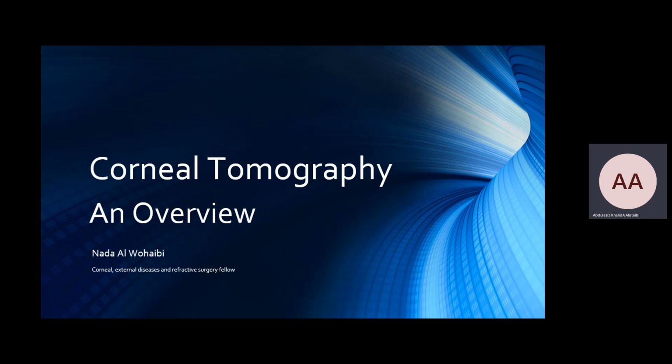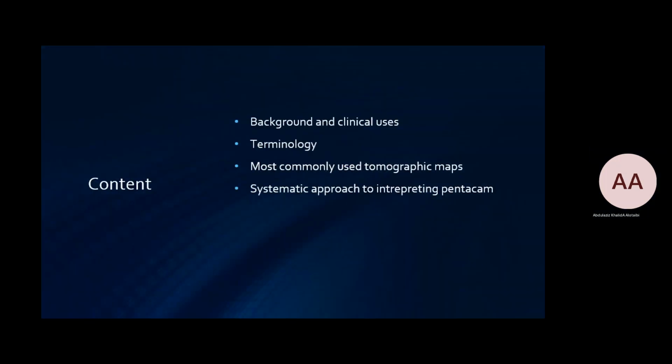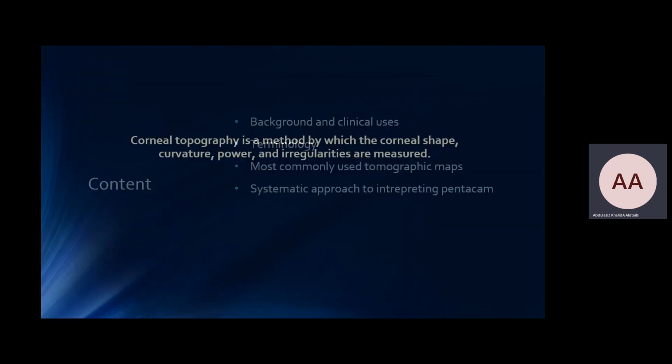Today we'll be talking about an important topic, which is corneal tomography. We'll be discussing an overview of corneal tomography. I hope you will find this colorful lecture beneficial, inshallah. Some background and clinical uses, some terminology, most commonly used tomographic maps, and a systematic approach to interpreting Pentacam.